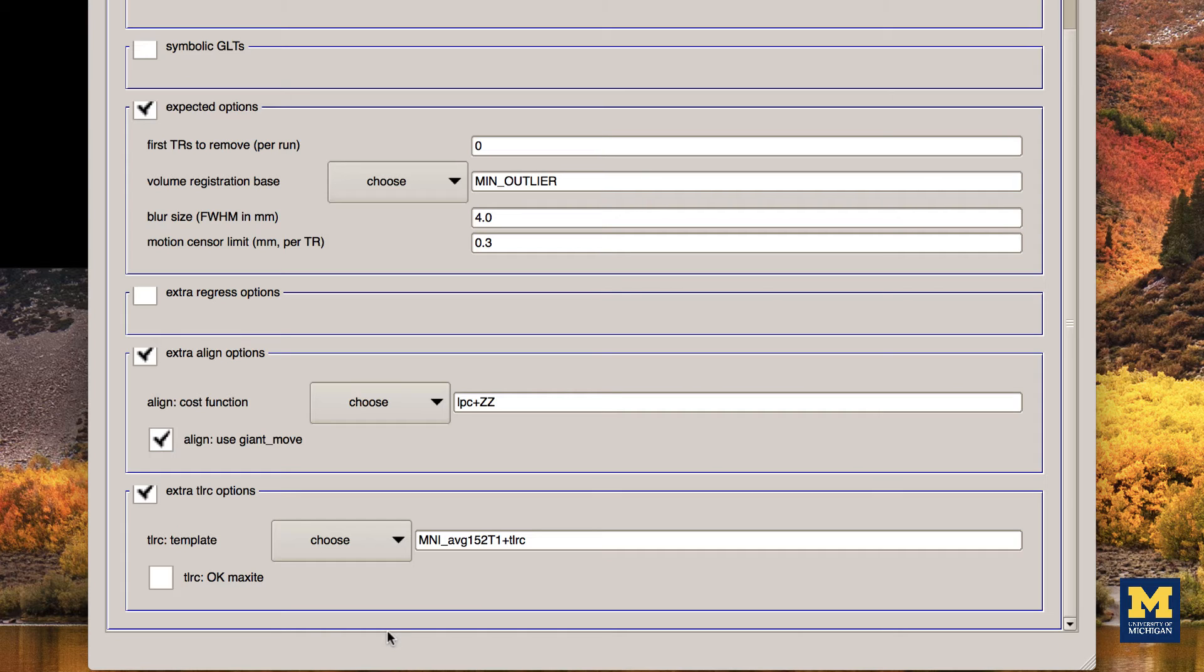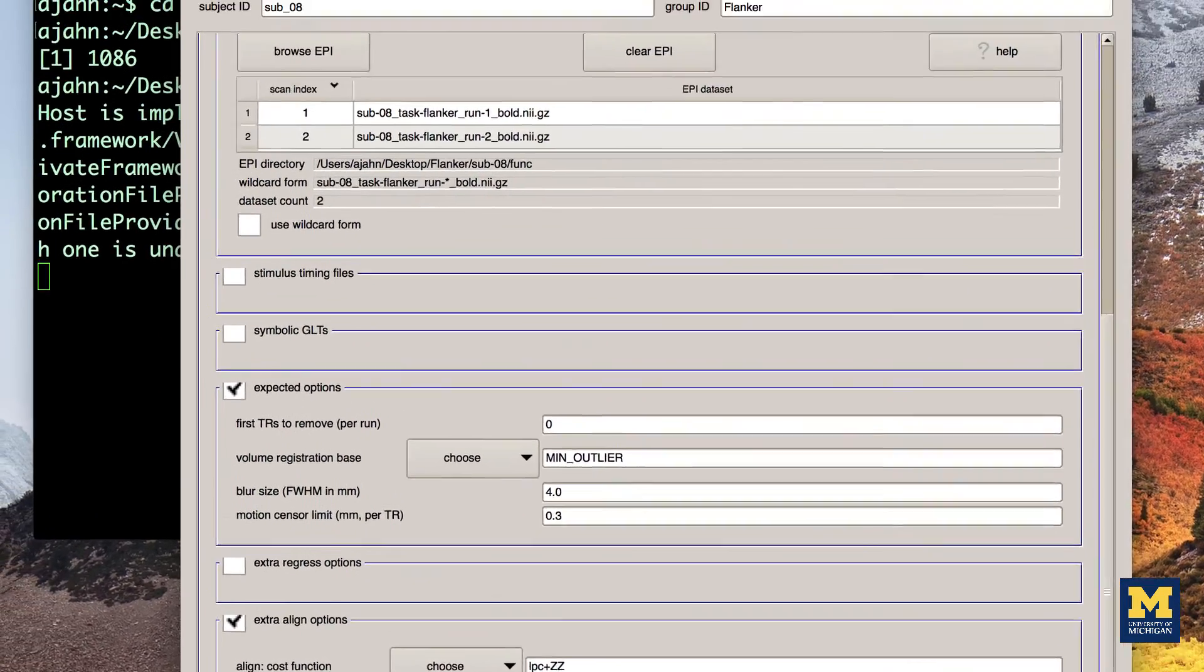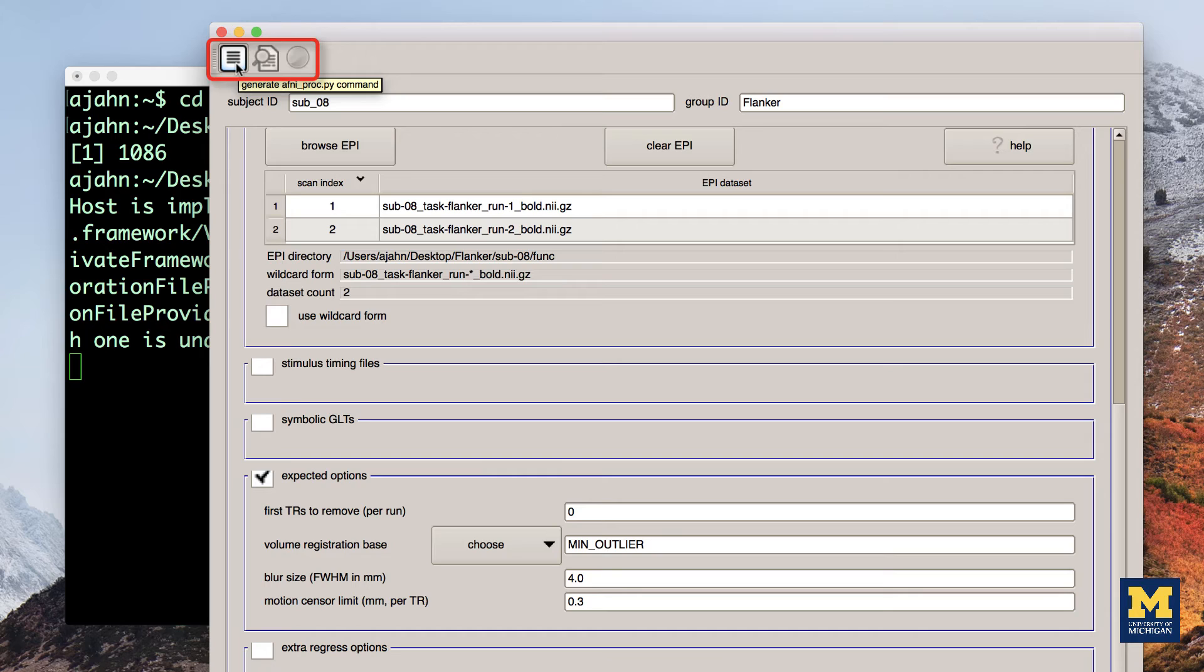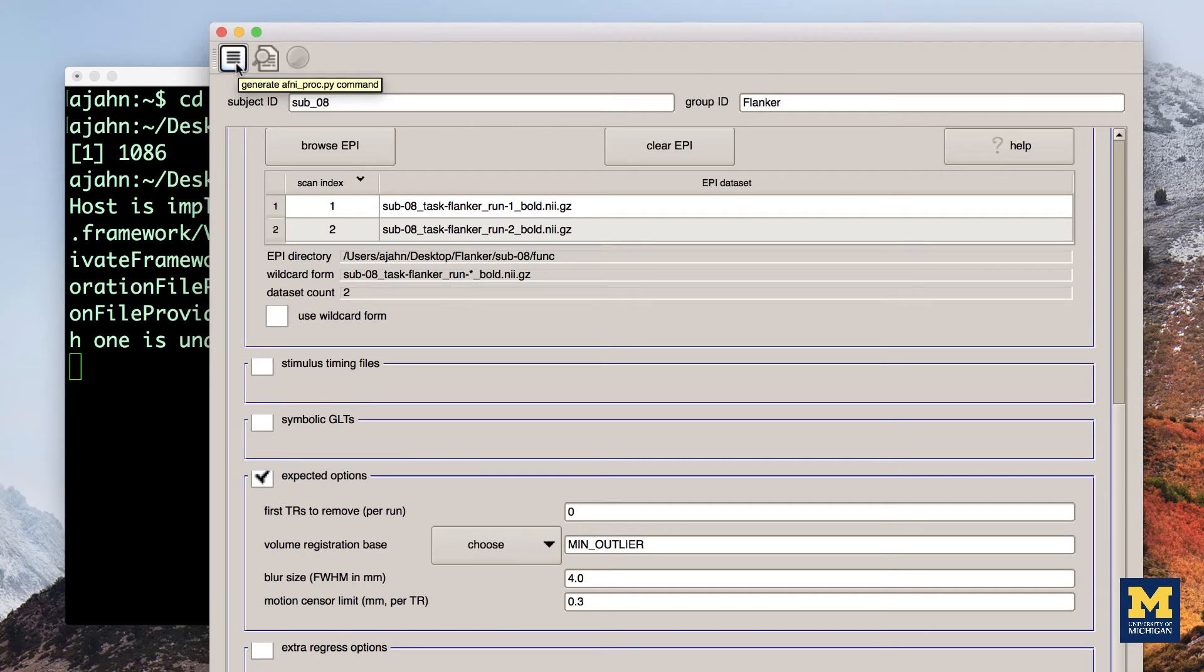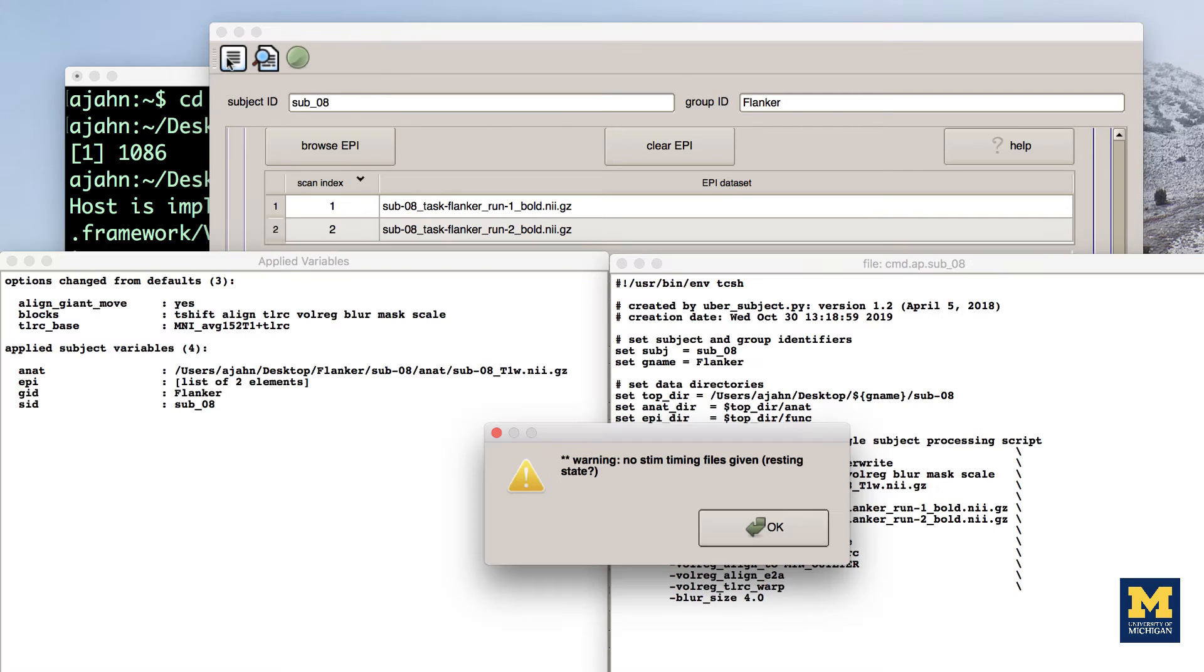When you are done setting up the analysis, you can execute it by clicking, from left to right, the three icons at the top of the GUI window. The first one looks like a sheet of paper with lines on it. This will generate the AFNI PROC PY command that includes everything you specified in the GUI. Click on the icon.